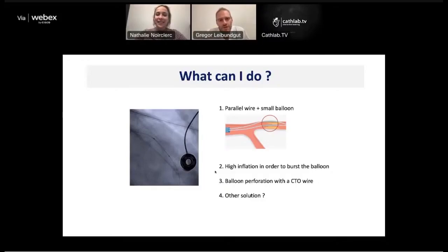But in this case, I tried to puncture the balloon from the backside with a lot of different devices. The backside of a wire, the Confianza, a Hornet, an Astato. I took even a Stingray wire, which is like a needle. I could not penetrate the balloon. Also, I took the tip of a syringe, which is cut, so it's sharp as a knife, and put that on a wire and went with the guide extension, safe, close to the balloon, tried to puncture, it won't puncture.